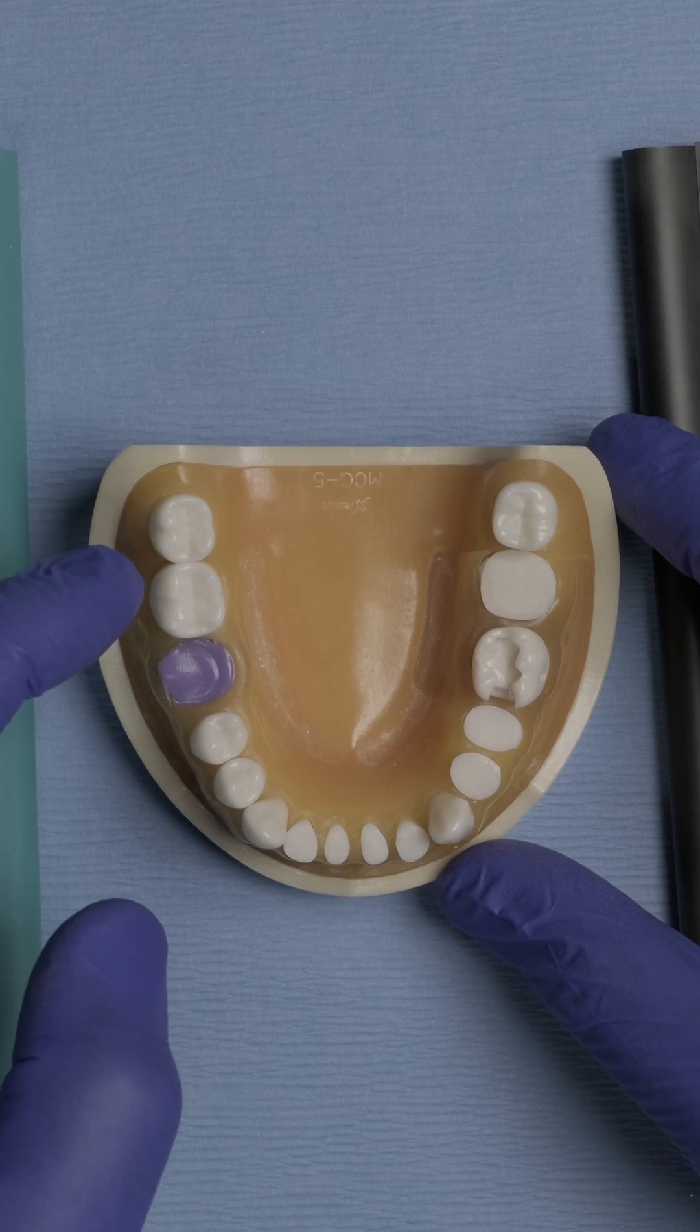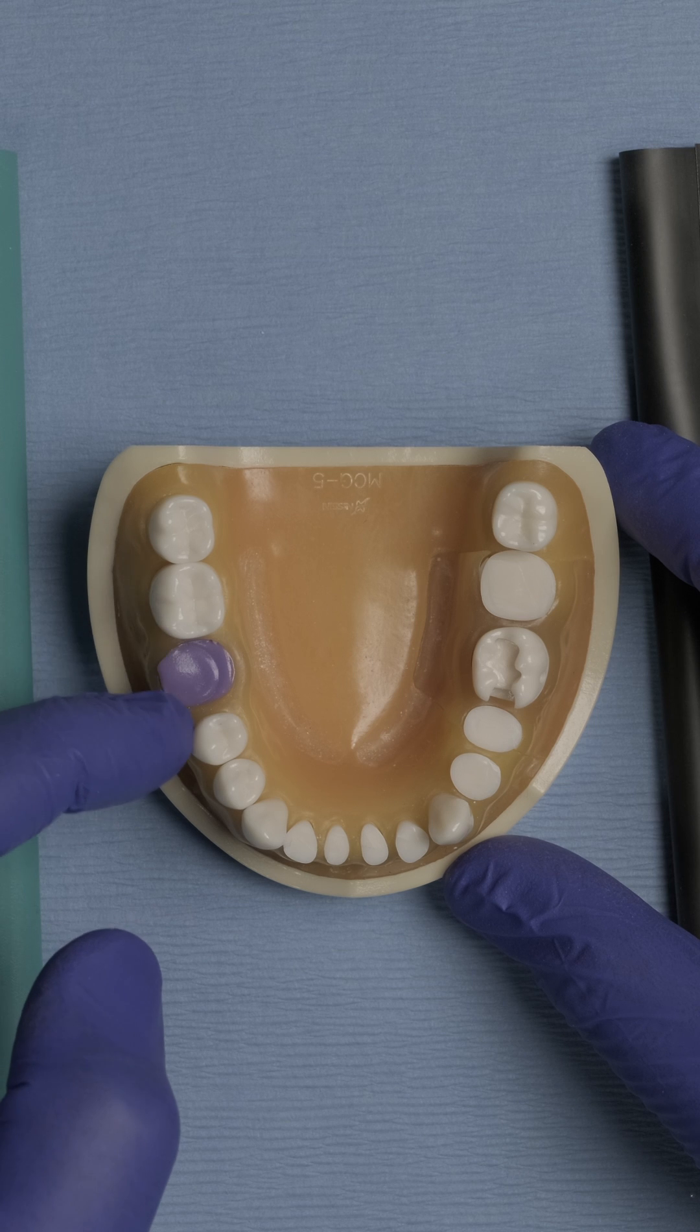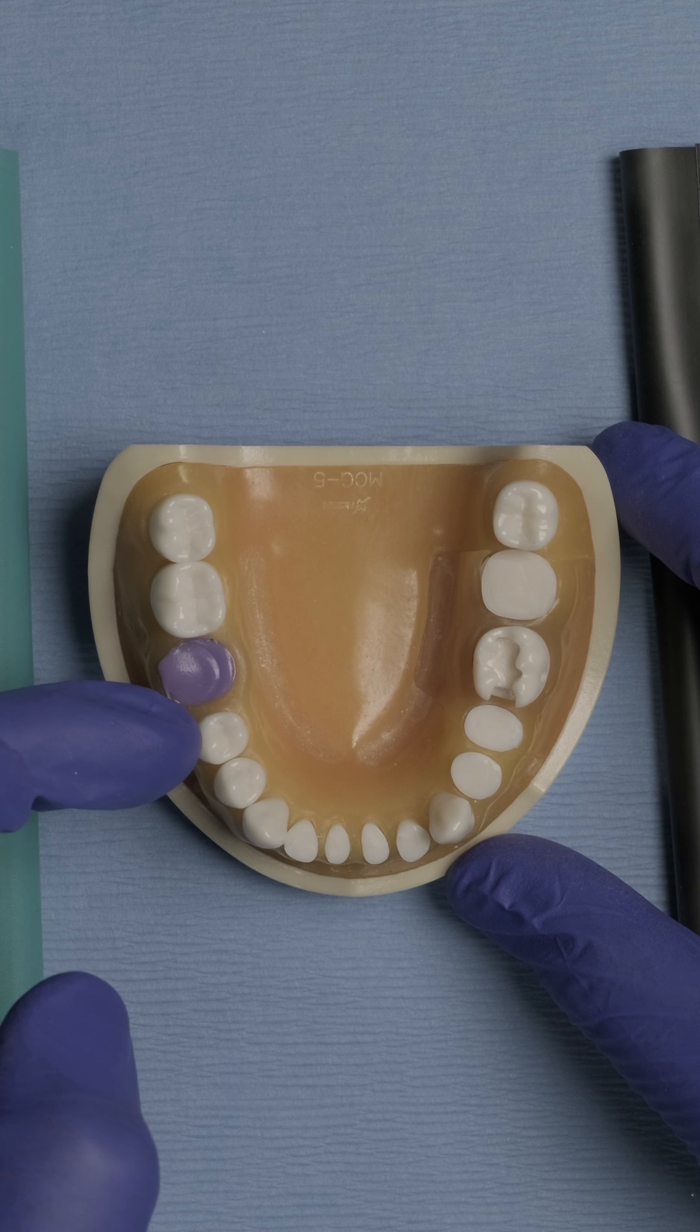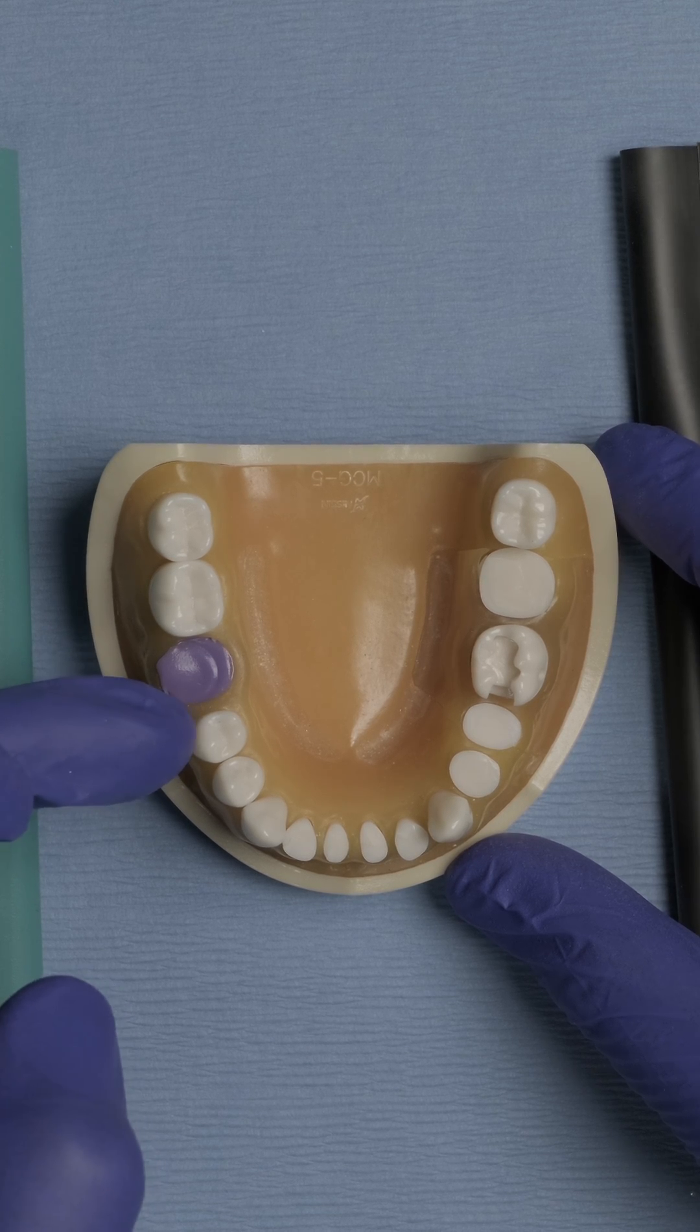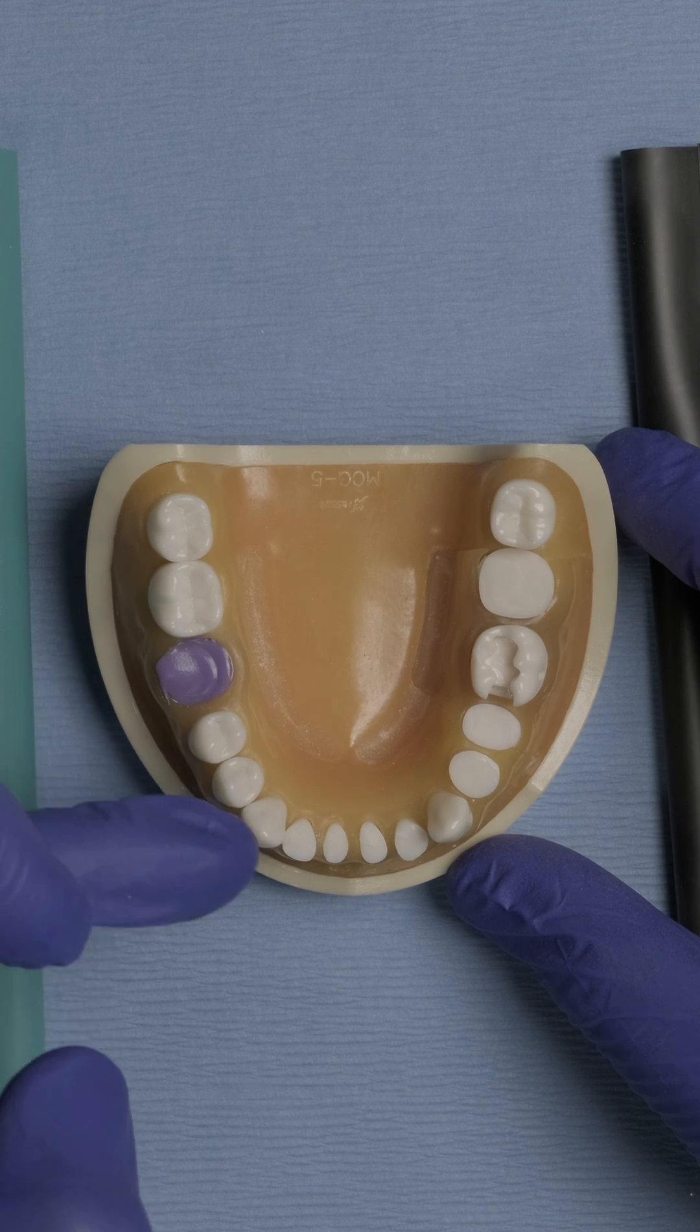So we're going to use a clamp around tooth number 31. We're going to allow the rubber dam to seal the area between 31 and 29, and then we'll also include in our isolation teeth 29, 28, and 27.